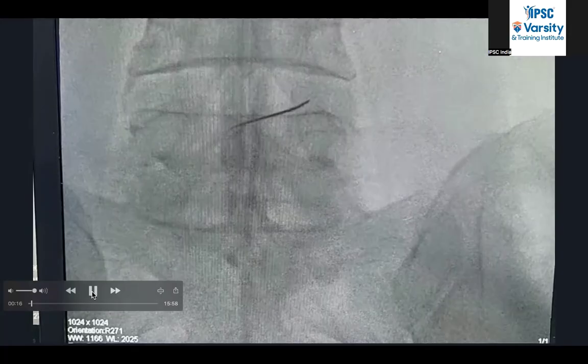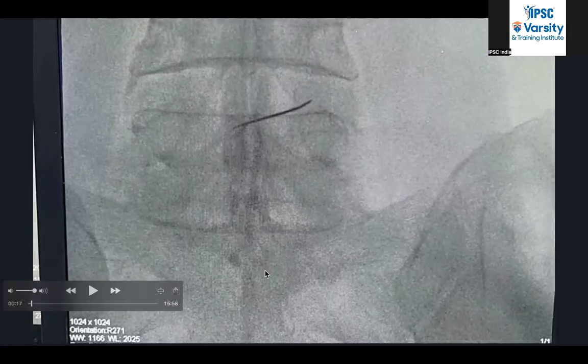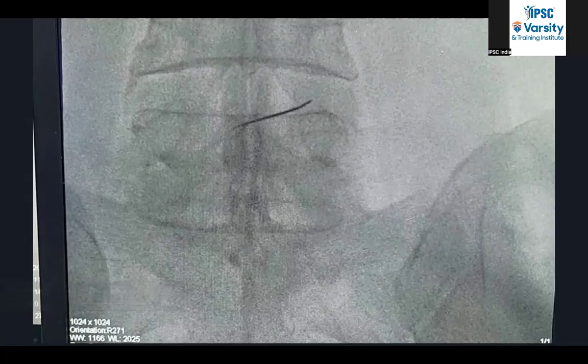This is normally what we do in our cases. We give the caudal epidural first, basically caudal analgesia, with 1% lignocaine and 0.25% bupivacaine, 10 ml. We inject contrast and see that we are covering the dural sac. This is important because we are going to handle the dural sac and the nerve roots, and pushing them medially may cause severe pain. So we have to anesthetize this area so that the analgesic effect will be there. For that, 1% lignocaine and 0.25% bupivacaine is sufficient.